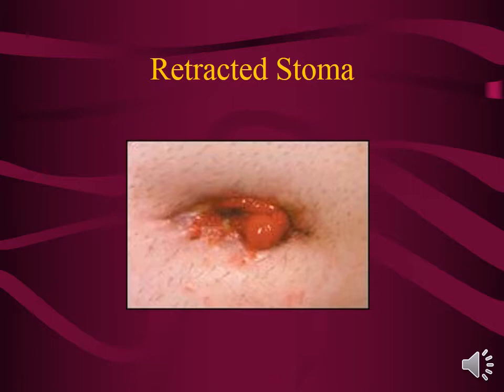Not only do you have to push against the abdomen to pull the stoma out, but you've got to have a flat plane or you're going to have stool leaking all in around these abdominal folds. So that is the art part of being a wound ostomy nurse, giving someone their life back that thought that they couldn't get out of the house, and teaching them how to do that piece.